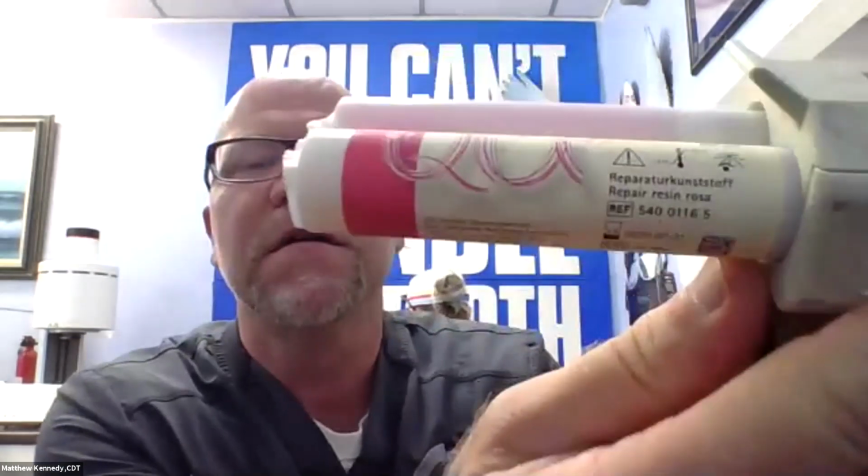We use the resin from Bredent, the Q resin, QU resin, self-curing, and we put it in syringes out of that container, and we'll use the syringes to lock them in. But the majority of our conversions, I don't actually bond the cylinders to the denture in the mouth. I do all of that in a sub lab. I use my conversion denture as an impression and also as a bite registration.